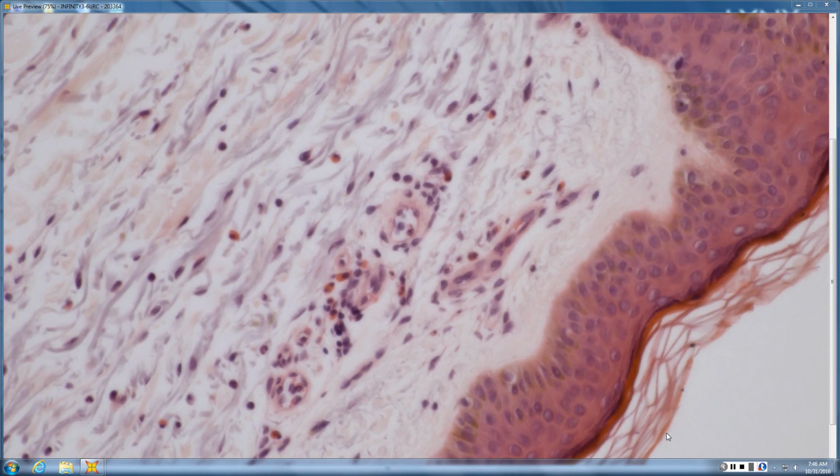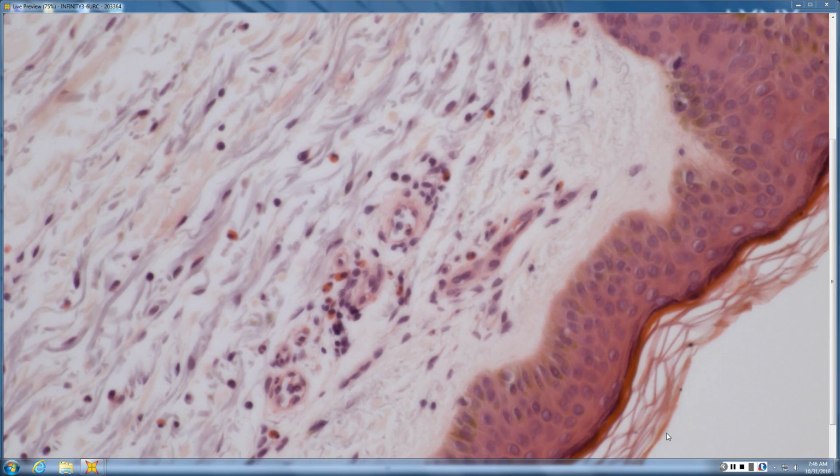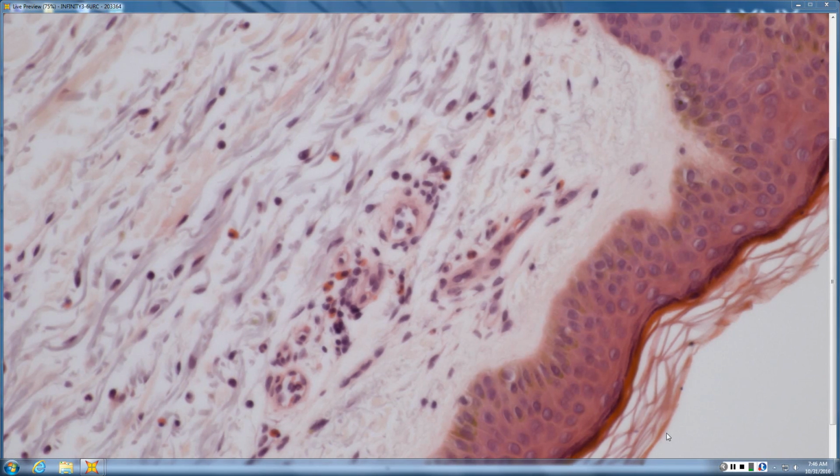So that's the life of an urticarial lesion. Name some other neutrophil-mediated dermatoses that can look sort of like vasculitis but aren't vasculitis. Sweet's. So Sweet's would be a classic one. What does Sweet's look like on scan? It's more dense, like a diffuse infiltrate. So nodular and diffuse infiltrate of neutrophils, karyorrhexis.